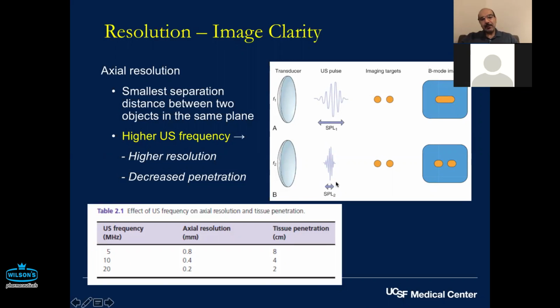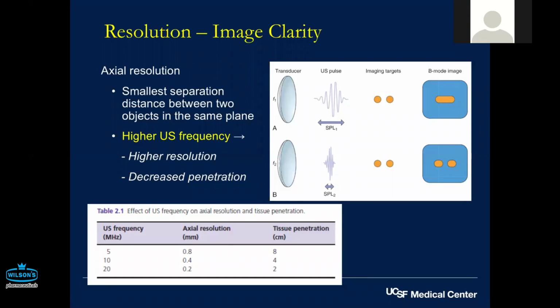But for the highest quality resolution, say of submucosal lesions, intraluminal lesions in the wall, GIST or a lipoma, those lesions will probably be best visualized with a higher frequency probe, and these typically end up being mini probes. A standard EUS scope will certainly give you very good quality images, say for a GIST, but to get the most clean image, it would be a separate probe that is a 20 megahertz probe, which is similar to a 10 French or 8 French catheter that has to go through the scope channel. So those are some of the other concepts.